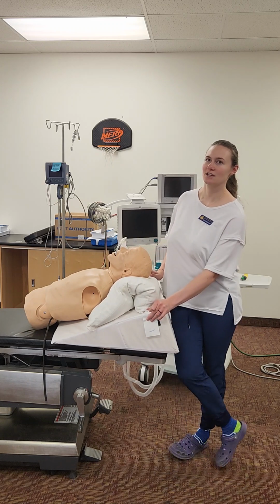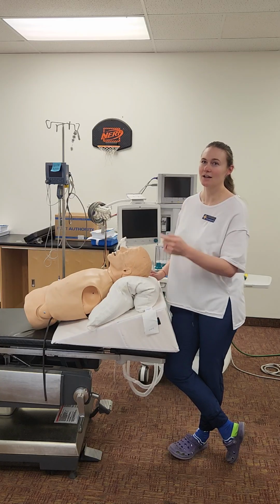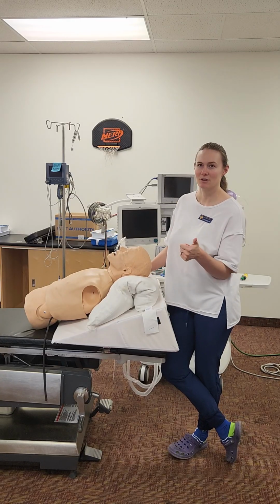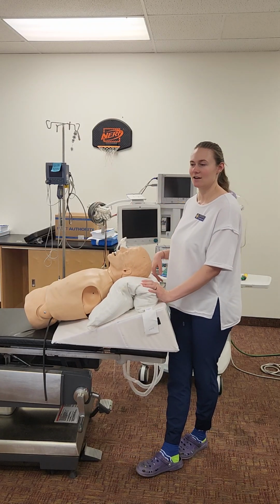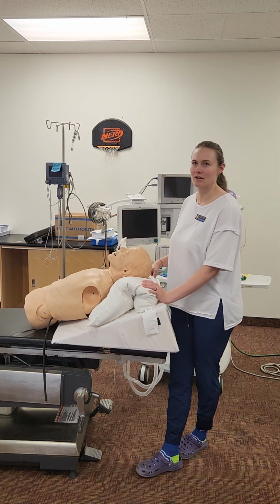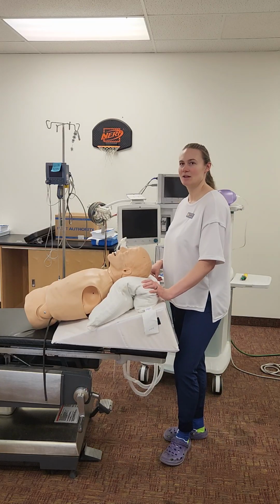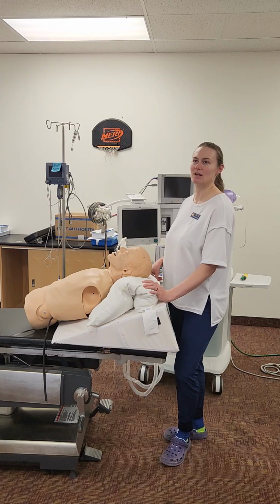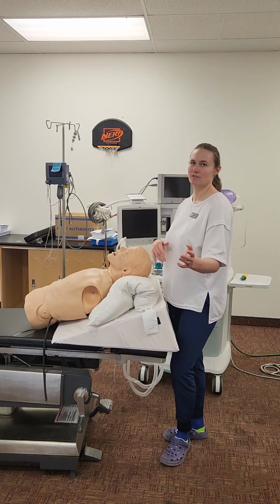And he looks like he has airway reflexes. He might be starting to bite his tube, he might be starting to cry. He'll be able to follow commands, he'll be able to give me thumbs up, he'll have good tidal volumes and good numbers on my machine, and I'll be able to see him moving air with my CO2. And then I'll ask him to lift up his head, and that'll pretty much be like the final thing for me, and if he can give me thumbs up and he's following commands.